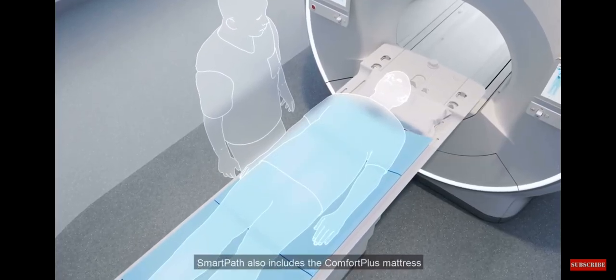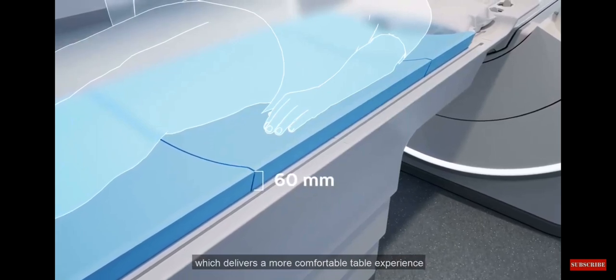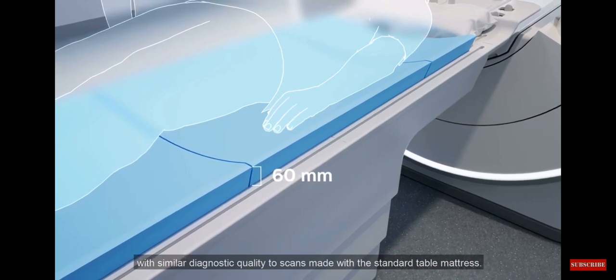SmartPath also includes the Comfort Plus mattress, which delivers a more comfortable table experience with similar diagnostic quality to scans made with a standard table mattress.